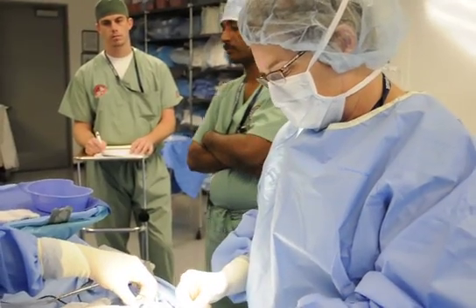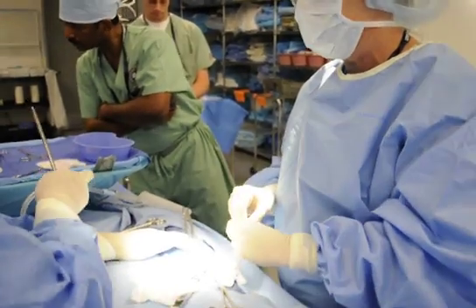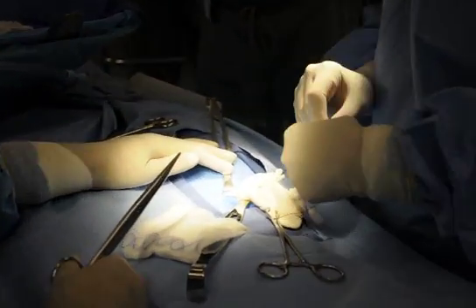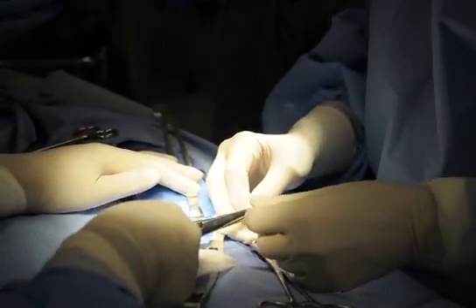When you do these scopes, you will see the artery occasionally doesn't get caught with the stapling device or whatever method they're using. And it does make a little tail.